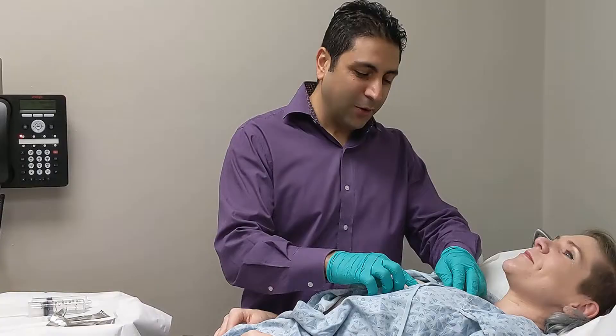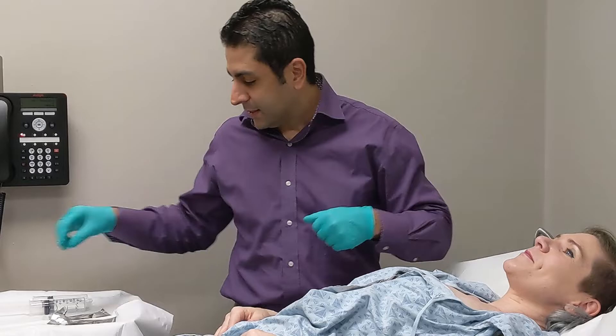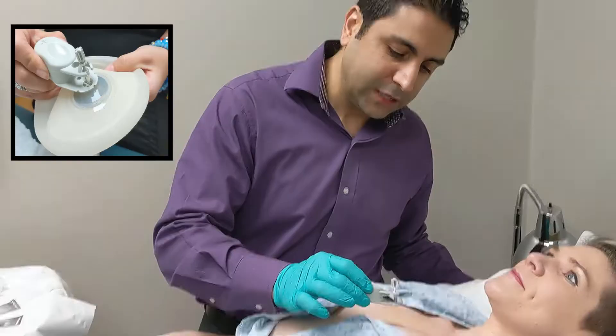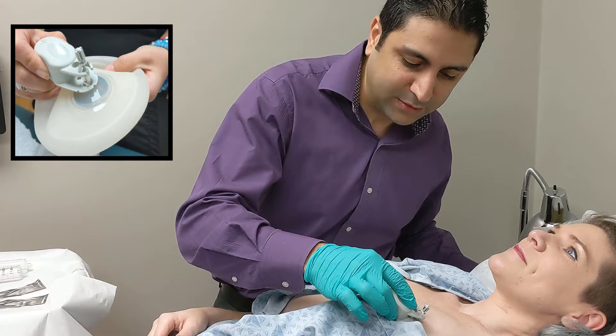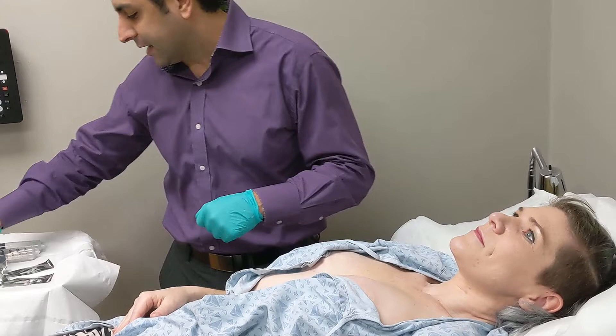What we're going to be doing right now is using a magnet. The magnet is kind of like a water finder — the good old-fashioned water finders used to find things underground. It finds where the port is. As you go around, you can see where the port is by being centered. I push down and I can see an X. When I see the X, I know that's where the port is going to be.